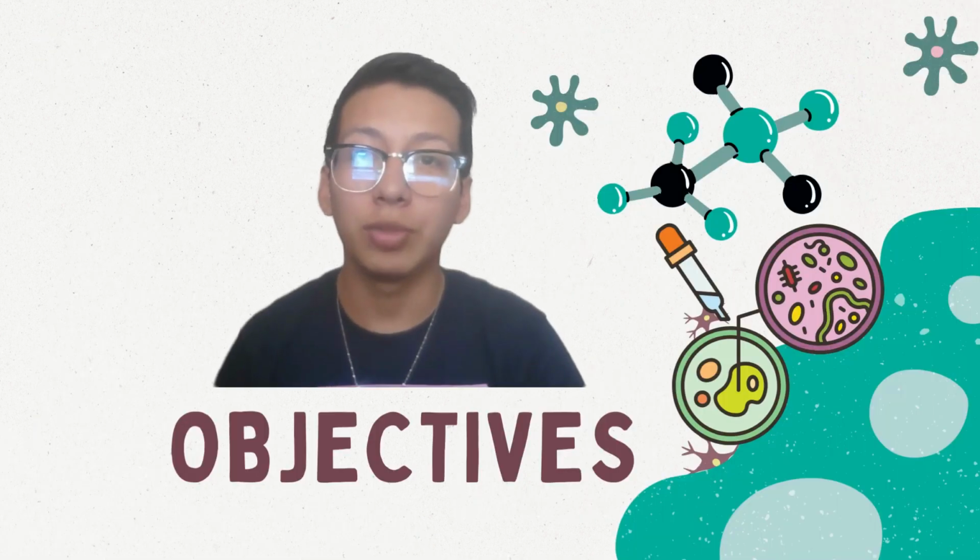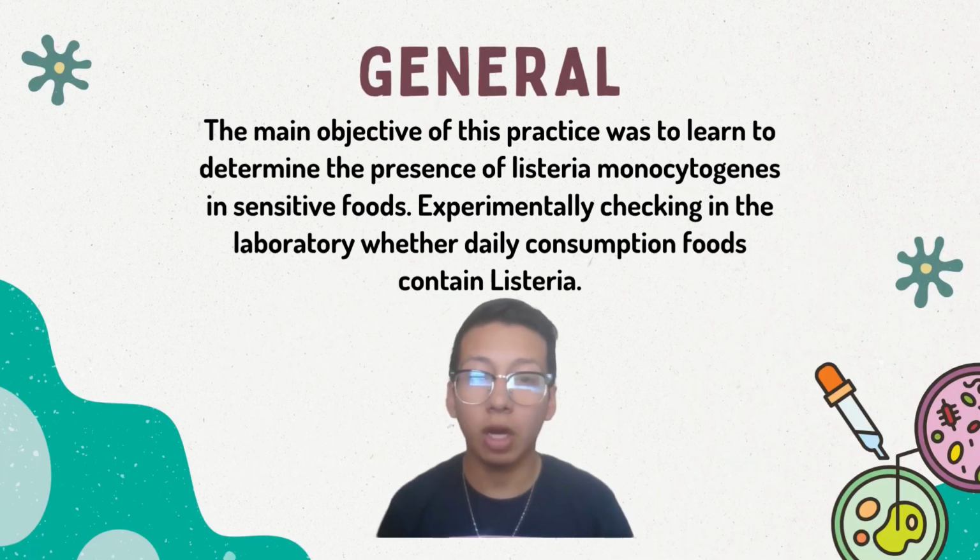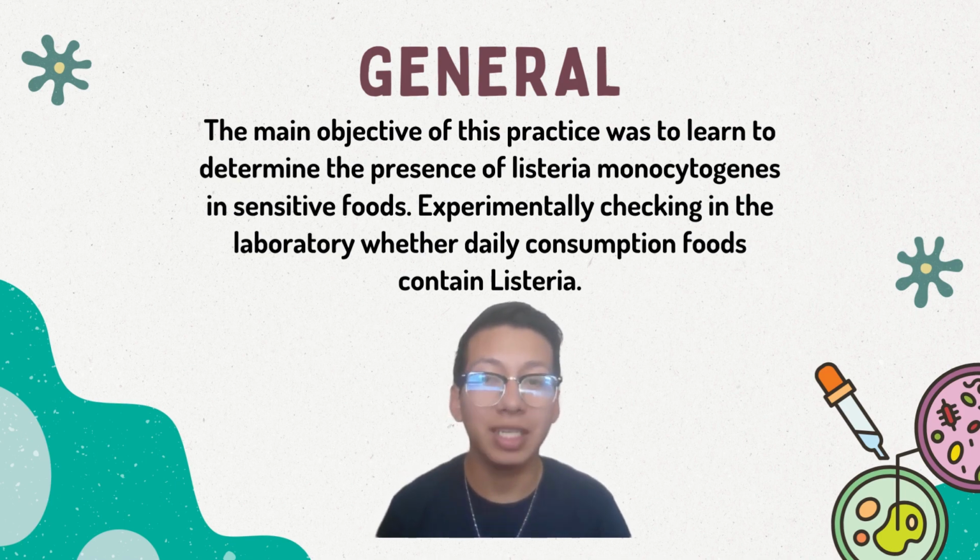Now, I'm going to present the objectives. The main objective of this practice was to learn to determine the presence of Listeria monocytogenes in sensitive foods, and also to experimentally check in the laboratory whether foods of daily consumption contain Listeria or not.